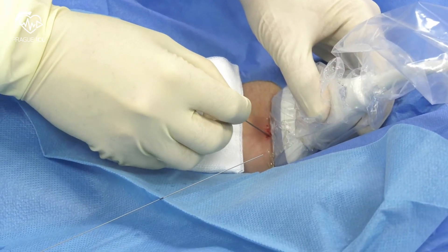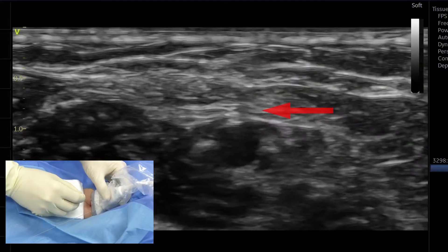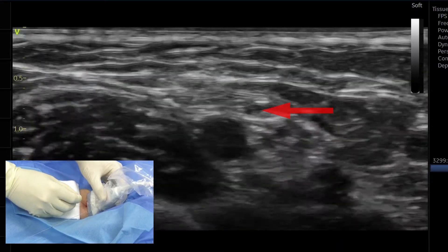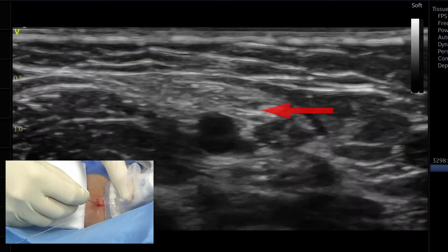Approach the introducer needle at approximately a 45-degree angle. The image of the needle tip needs to be followed at all times. Tilting and tiny shifting of the probe help to optimize visualization of the needle tip.